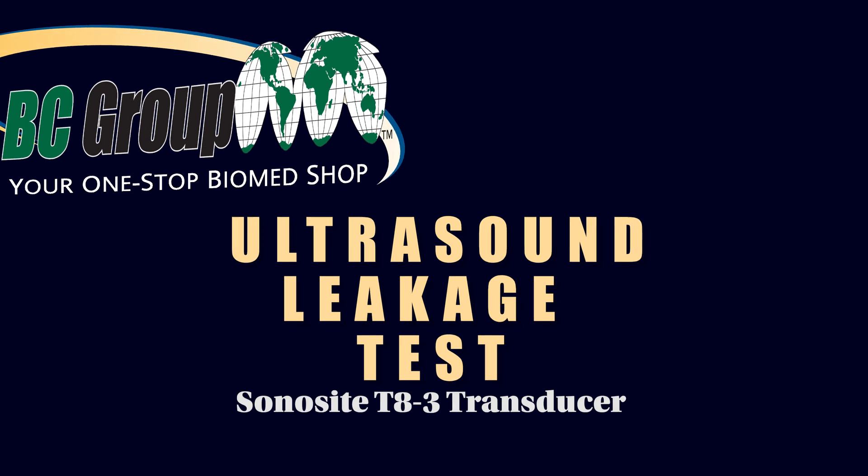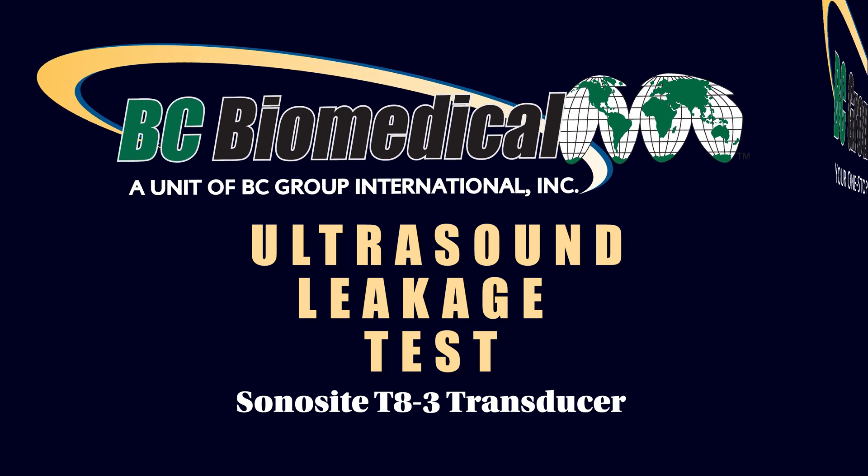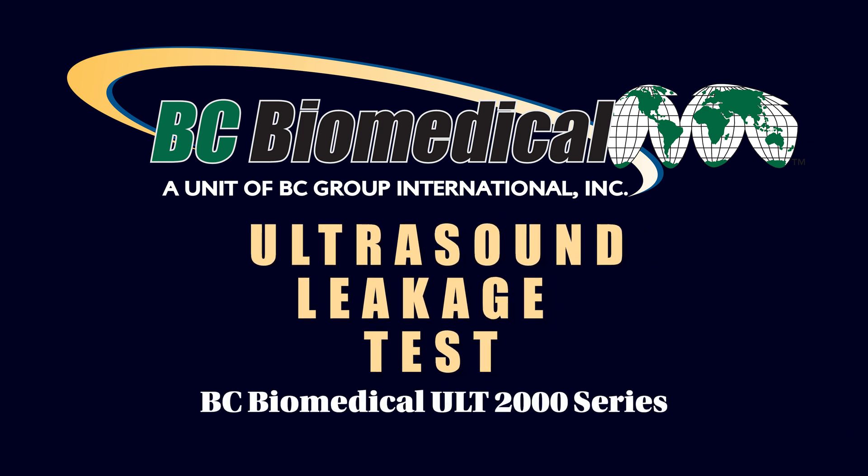Welcome to an educational video from BC Group International. Today we will show you how to perform an ultrasound leakage test with the Sonosight T8-3 transducer using our BC Biomedical ULT-2000 series.